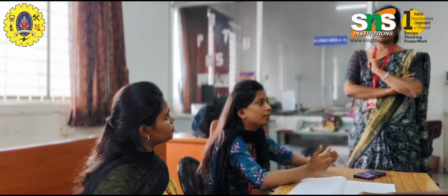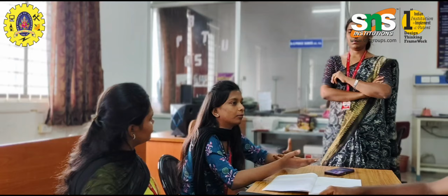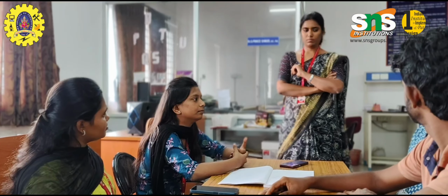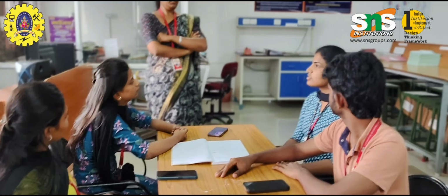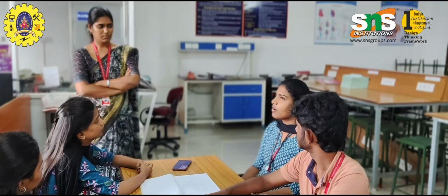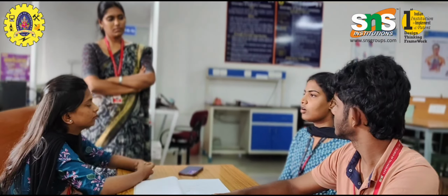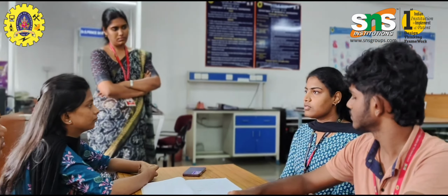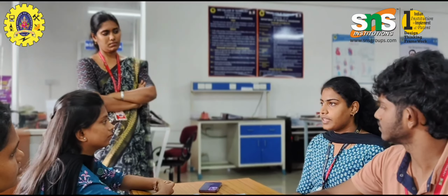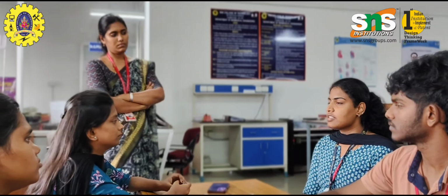contact is there. But I have a doubt, like why is bipolar more convenient than monopolar? So I think bipolar is used for precise surgeries and it ensures safety, because once in a cosmetic surgery unit there was a fire accident in the operation theatre. It was due to using an alcohol-based prep solution. It was not fully evaporated and the active electrode ignited the vapors, causing burns in patients.